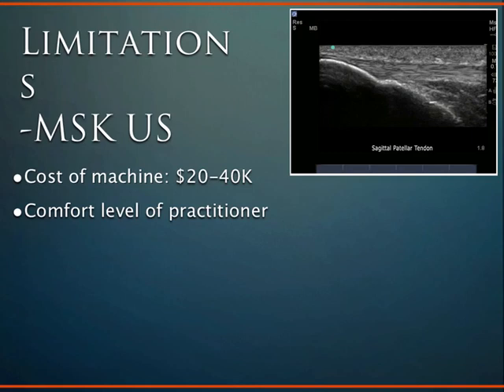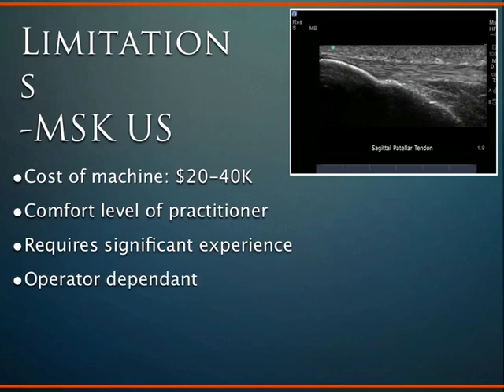Some of the other limitations, as I was alluding to initially: it really is practitioner dependent. If the practitioner isn't in control of their anatomy knowledge, or isn't experienced with the modality, it requires a lot of time and investment in extra education, and it takes years to get comfortable with. And as I mentioned, I'm still working up to that. So it is very operator dependent.